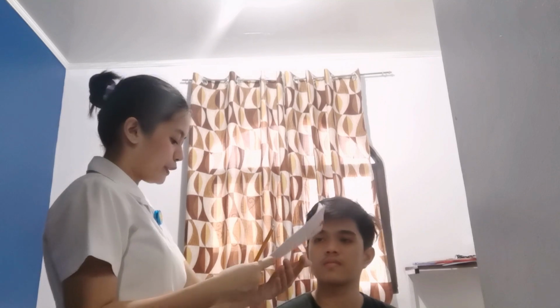The eighth step is to assess if there is a contraindication for taking the blood pressure on either arm, because this will help to ensure accurate interpretation. Mr. Detoyato, have you ever experienced paralysis? No po. Do you have any arm injury? Wala po.